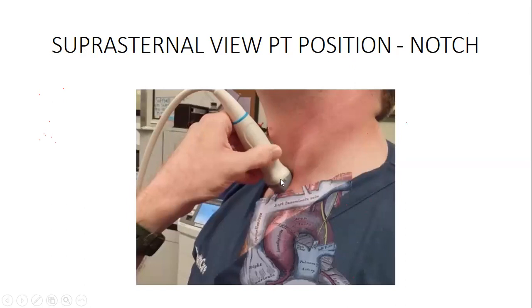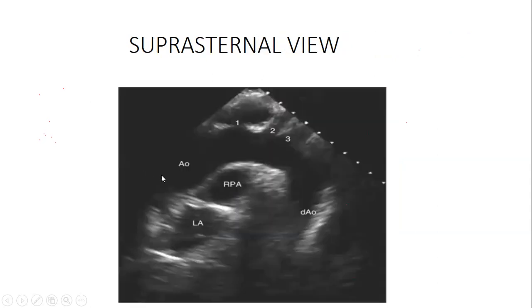So this is how you put your marker: one points to the head, and the other one points to the left. You're going to have that structure that you expect. How does it look? It looks like this. So this is now the aortic root. Imagine from the left ventricular outflow tract, it's coming out now, the ascending aorta.